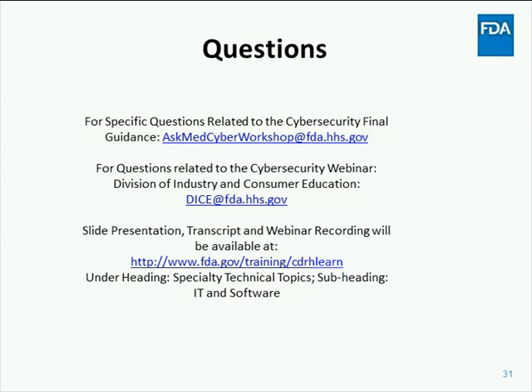Yes, again, excellent question. And we did address this in the document. We know that 14971 explicitly states for software issues, defects, and sabotage, it is exceedingly difficult to calculate the probability of, say, exploitability. And that you assume that the probability of exploit is 1, you assume failure. We recognize that. However, we didn't think that was very helpful for manufacturers and other stakeholders to triage various vulnerabilities.